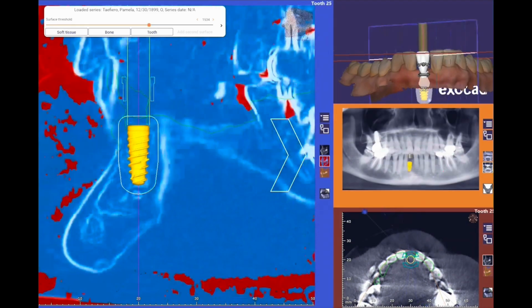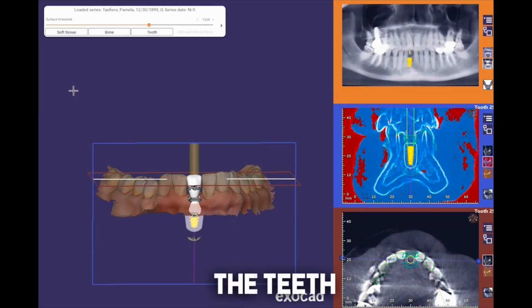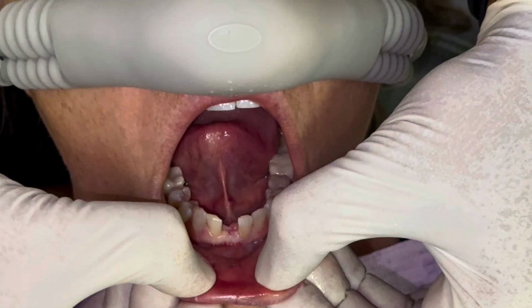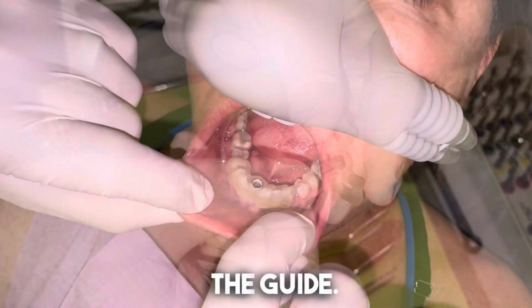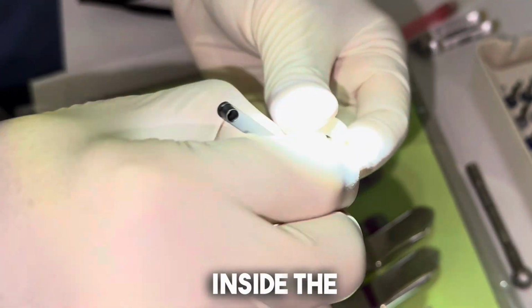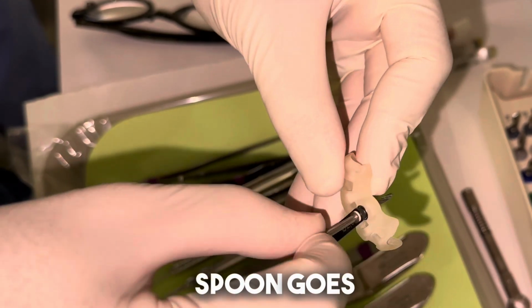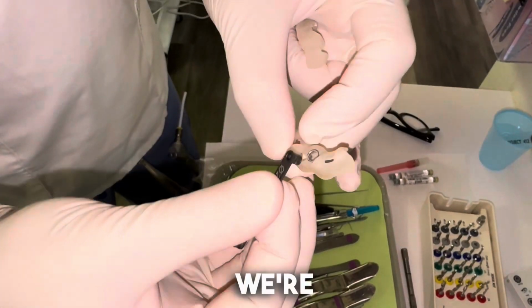So as you can see, again, that's where the implant is located, in between the teeth, and how the crown looks. At this point, we're looking at the fit of the guide. As you can see, it's passively fit. And these are the spoons that we use. Inside the guide, there's a sleeve. And I'm showing you that the spoon goes in there, and also the drill. And the drill, we're testing it out.